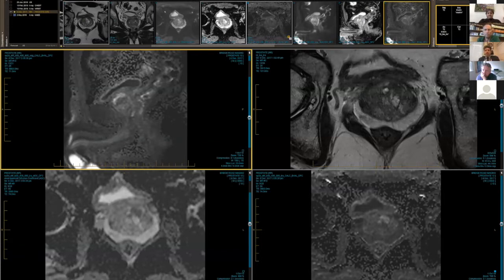PI-RADS 3, yeah, is reported a lot. It's probably more than what it should be overall, because I think there are legal reasons, so that when you have any doubts, you prefer to give a PI-RADS 3 rather than to give nothing. And also the other thing that we noticed is that really few radiologists give 3A or 3B as a classification, probably because they don't want to give an indication to go or not to go for biopsy. Yep. All right. Well, we better keep moving.